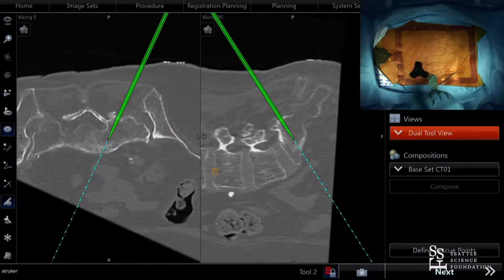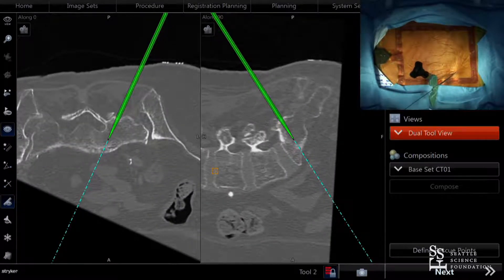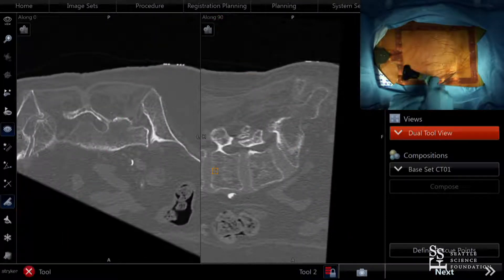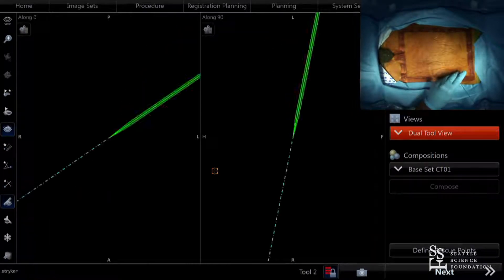This is a three-dimensional fluoroscopic image rather than a true CT scan — though it gives you a three-dimensional reconstruction similar to the ISO-C. It does provide 3D imaging for navigation purposes.